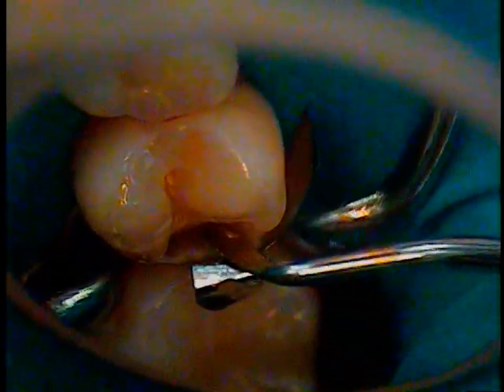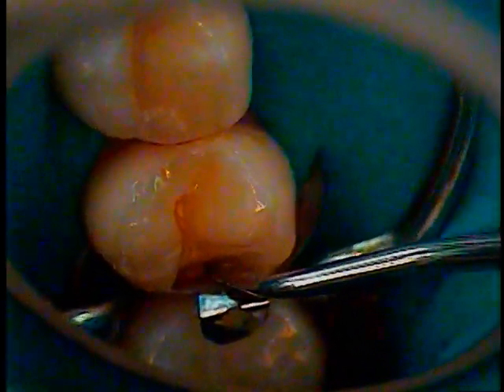Okay, so I like that. A little bit is up against this wall, a little bit against this wall, so that reduces the C factor tremendously. Okay, now cure it. Building in success. That's how you do it.